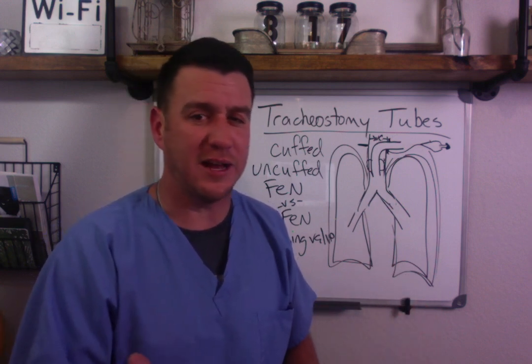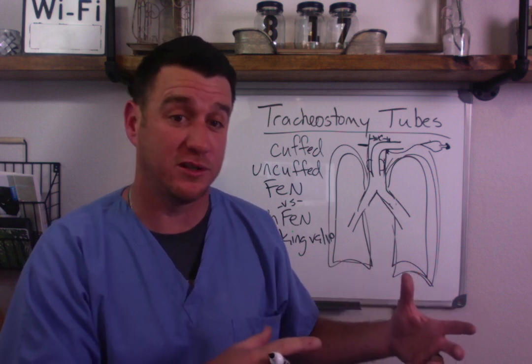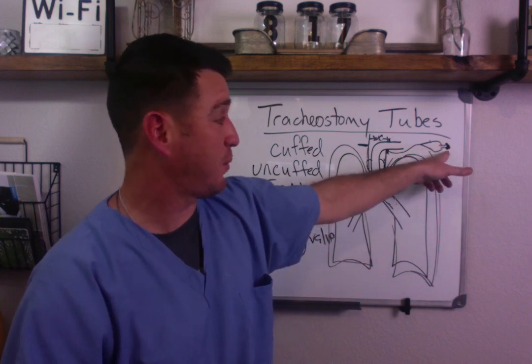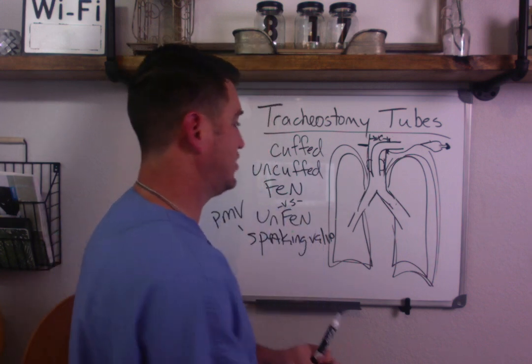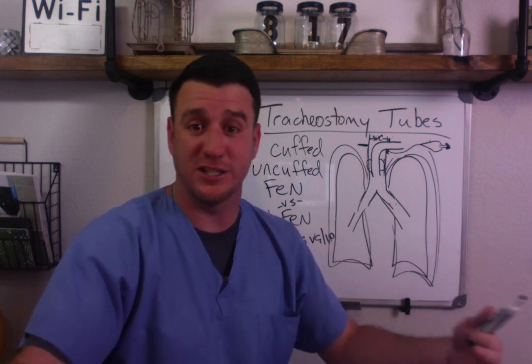So you've got to understand that the Bivona foam trach is the opposite of everything else. It inflates automatically. You have to actively deflate it and then close this to ambient pressure to prevent it from reinflating. So keep your eyes open for the Bivona foam tracheostomy tube. You don't see them a whole lot anymore, but I still feel like my duty is to share this information with you.